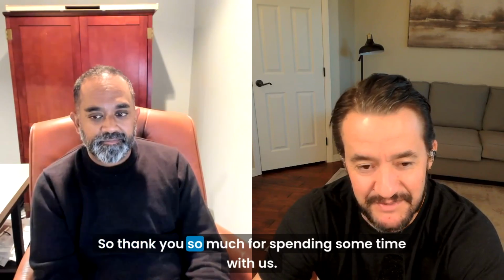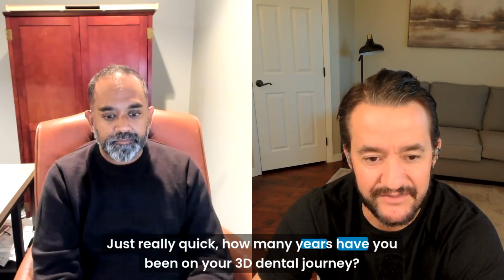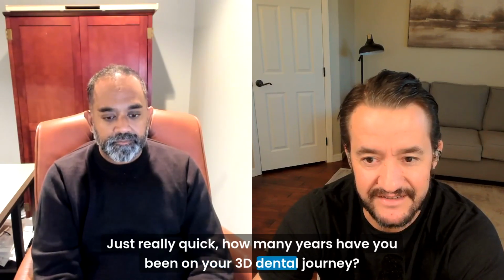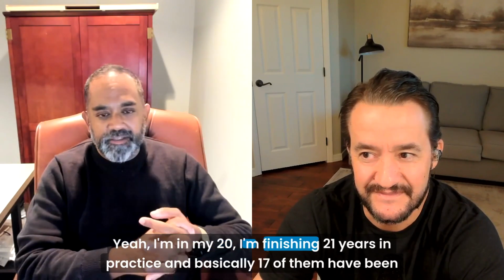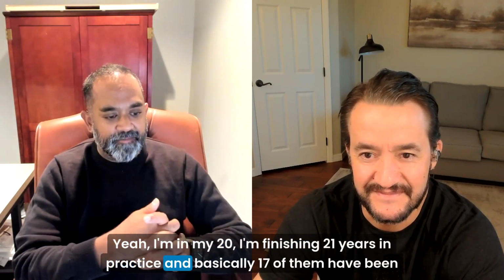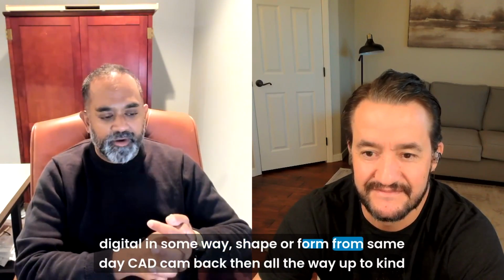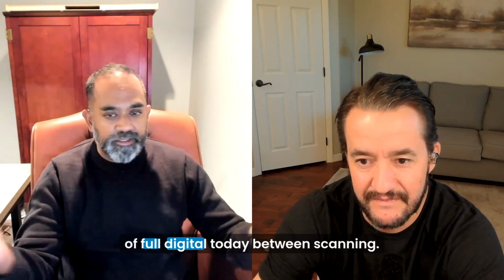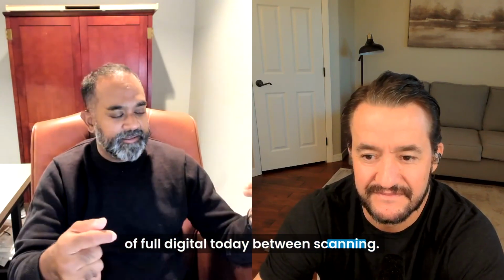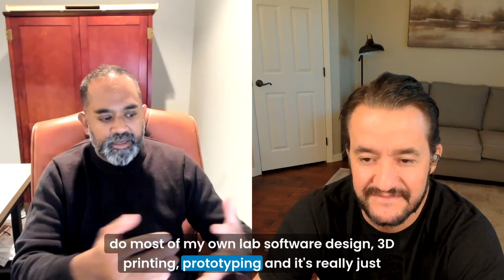Thank you so much for spending some time with us. Just really quick, how many years have you been on your 3D dental journey, and where are you at today? Yeah, I'm finishing 21 years in practice, and 17 of them have been digital in some way, shape, or form, from same-day CAD/CAM back then all the way up to full digital today, between scanning, doing most of my own lab software design, 3D printing, and prototyping.